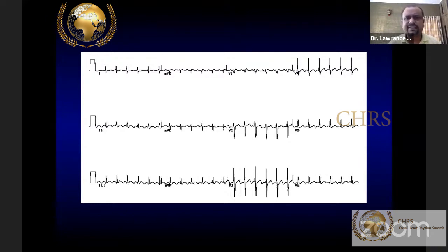If you have seen a sinus tachycardia, I think most of you would have observed that the tachycardia rate changes. The rate goes to 145, 148, 150, 156, something like that. It changes most of the time. But in an atrial flutter, if you put a monitor on and you just sit there and watch, it will be fixed at 150 beats per minute. The reason being, the atrial rate is 300 beats per minute and it's conducting a 2:1 conduction. That means your heart rate will remain at 150 fixed.